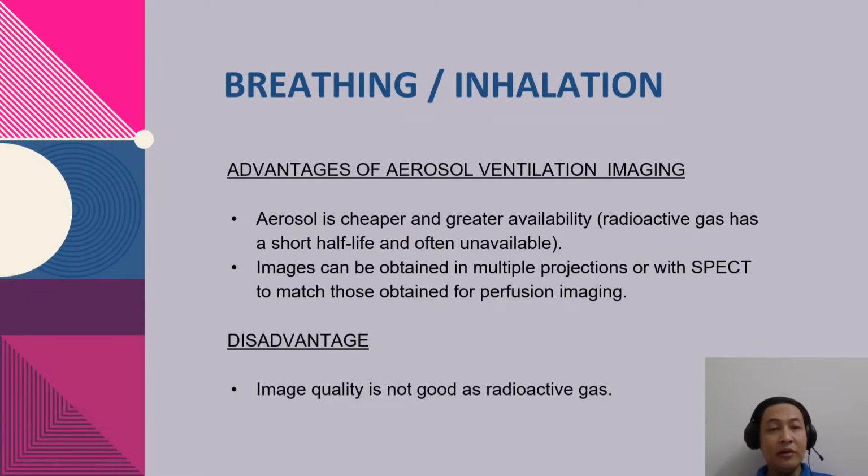This is the advantage of aerosol ventilation imaging. Aerosol is cheaper and has greater availability. Radioactive gas has a short half-life and is often unavailable. Images can be obtained in multiple projections or with SPECT to match those obtained for perfusion imaging. The disadvantage is that image quality is not as good as radioactive gas.